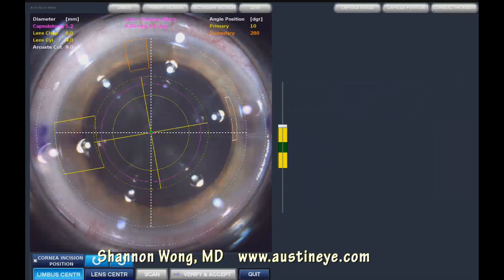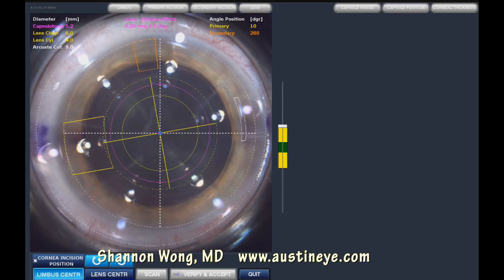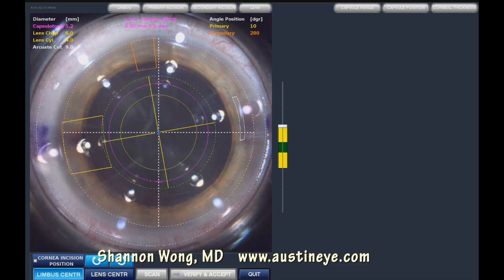This is Dr. Shannon Wong. I'm an ophthalmologist in Austin, Texas at Austin Eye. I'm going to demonstrate this case involving a 57-year-old patient who has 8-incision RK previously.